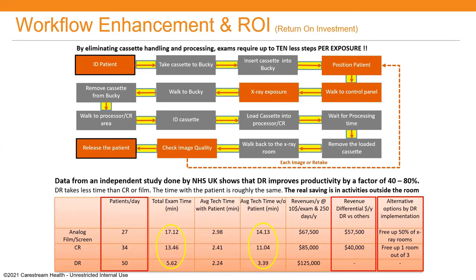So if you're talking about the activities related to the time spent by the technologist with the patient, you see that there is not much difference among the technologies, because more or less you need to keep positioning the patient and explaining what you're doing and so forth. So you don't have a big improvement. But when you look at the other activities done outside the patient, there is a big improvement when you move to DR.